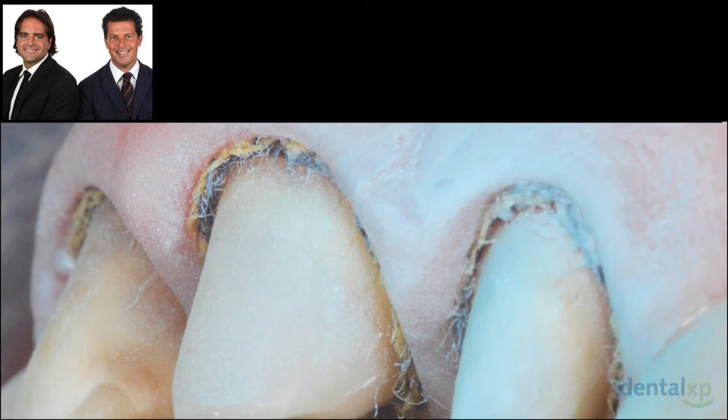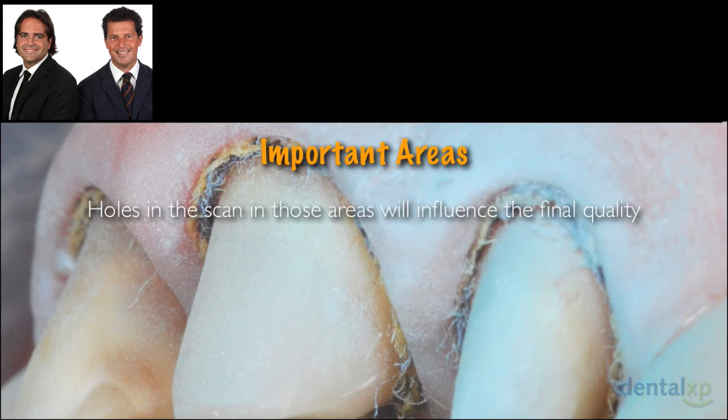But before, we have to know that we have to follow some protocol, especially when there is something new in our protocols, in our procedures. We have always to follow a protocol. And first of all, we have to know digitally that there are some important areas in where holes in the scan will influence the final quality.